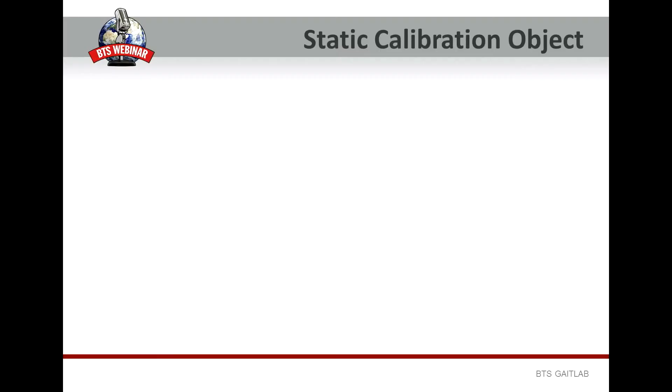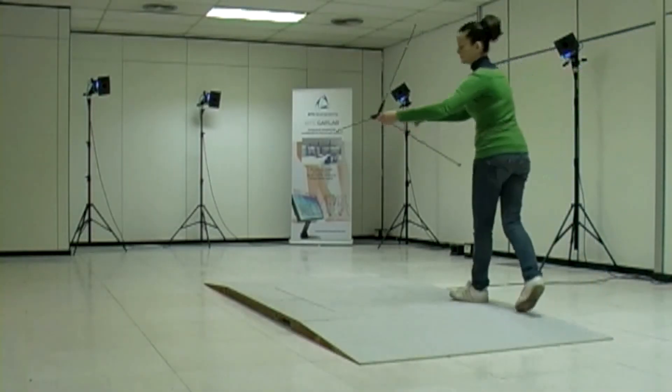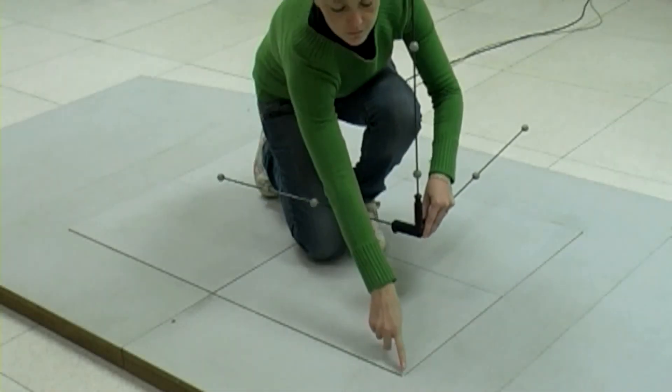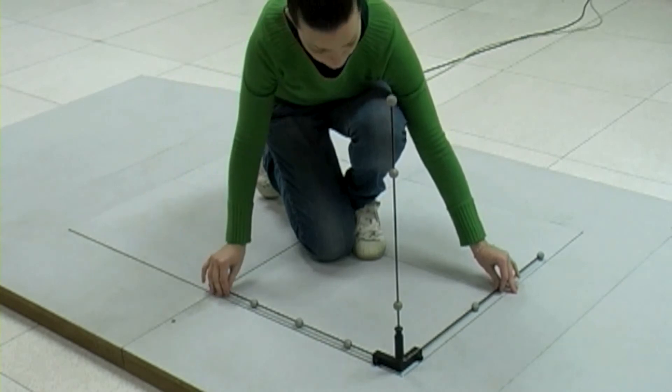The static calibration has to be performed by means of a calibrated object which has an origin and a different number of markers along its 3 perpendicular axes. The origin is at the vertex of the 3 axes: the 4-marker axis defines the x direction, the 3-marker axis defines the y vertical direction, and the 2-marker axis defines the z. Theoretically this object can be placed anywhere in the captured volume, but during a gait analysis with force plates it is suggested to place the static calibration object on one of the force plate corners. Now I'm going to place the origin of the axis on this corner of force plate number 2, with the x axis aligned along the main working direction and the force plate long axis.